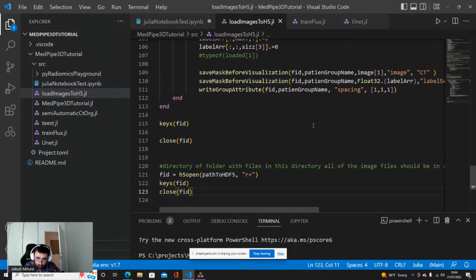I am, for example, now working on the prostate MRIs, and I am working to fuse different architectures. Yes, so fuse, for example, the supervoxel architecture with the Siamese neural network, with the graph neural network, and all of them put into one big chain of the backpropagation. This is just the work that I started, so I cannot show you any results. But this is something that would be extremely hard to achieve in another language.